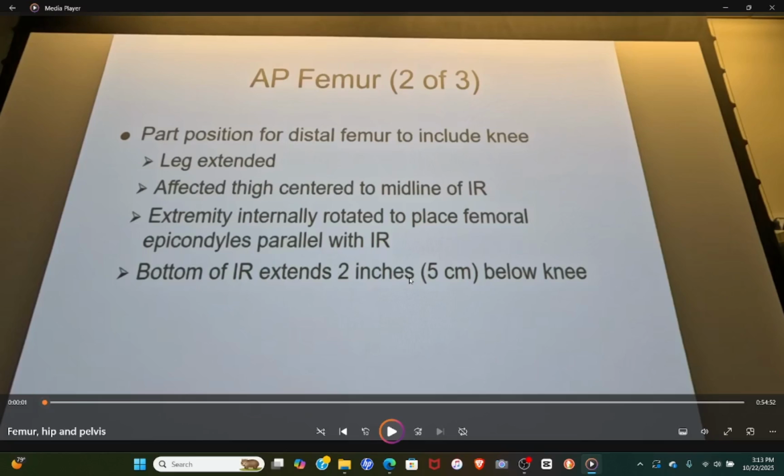And the reason for that is because in a femur, we've got anatomy that's thick enough that it creates a lot of scatter radiation. So scatter radiation increases as tissue thickness increases. And if we get to 10 centimeters or above, we need to utilize a grid to absorb some of that scatter radiation. Grids will be discussed later in the curriculum, but thick tissue, especially water-based tissues, create a lot of scatter radiation that emit from the patient, and they create fog on the image. And we've got to get rid of that somehow or another. And how we do that is with a grid.